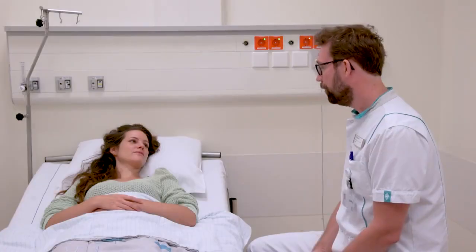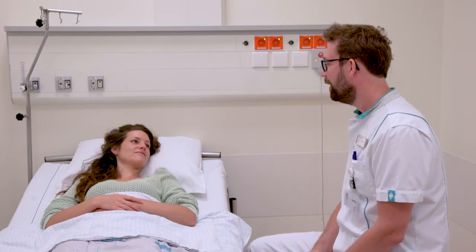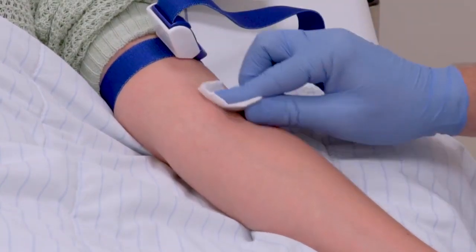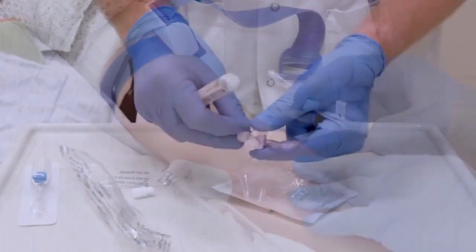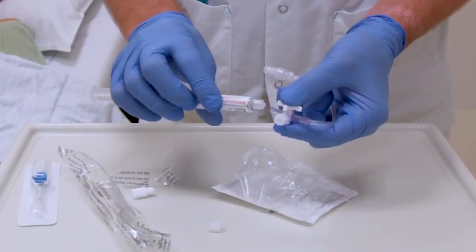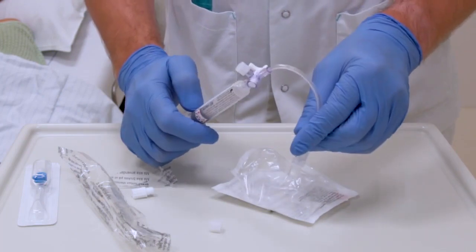Prior to administration of the radiotracer, it is important to measure the patient's blood glucose. After explaining the preparation and imaging procedures to the patient, insert a peripheral venous cannula into one of the antecubital veins of the patient and attach a three-way stopcock system with a luer lock to a 20ml syringe of saline.